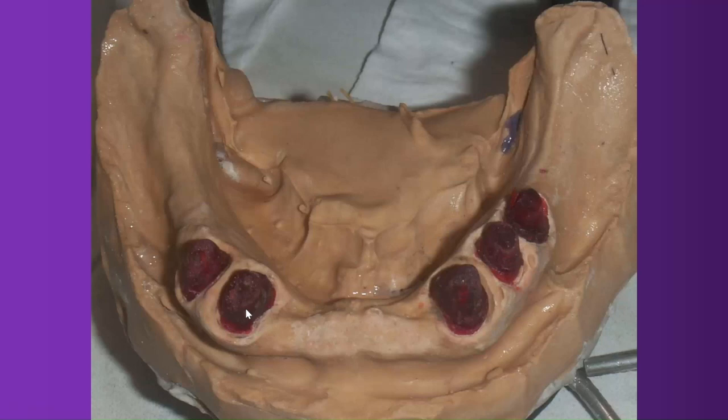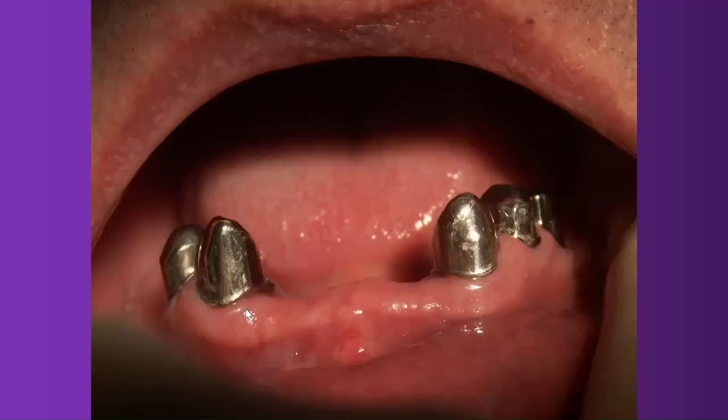Now that cannot break. And on this model, with resin abutments, as you can see, this allows me to replace the model at the parallelometer and place the metal copings over. I will find again the insertion axis. I won't tell you how, it was not easy. And then I would mill it again, refining the milling in metal to make it perfectly 0 degrees like that. Mirror shine. That's the image as they are positioned intraorally.